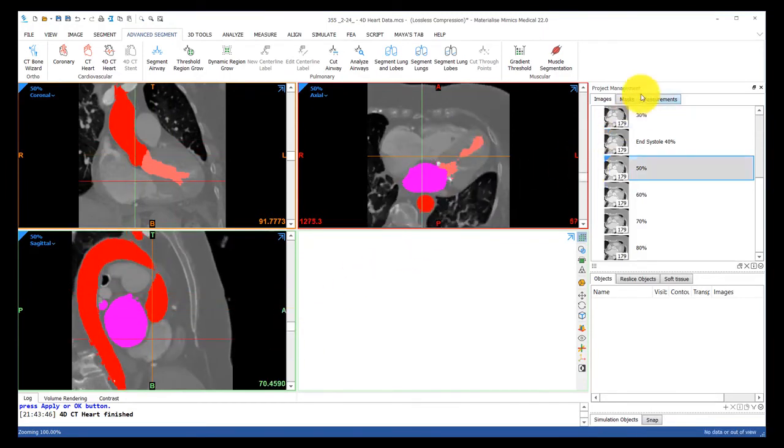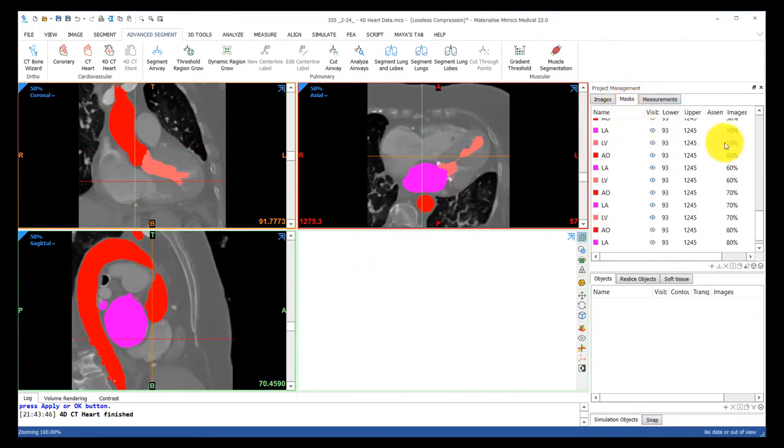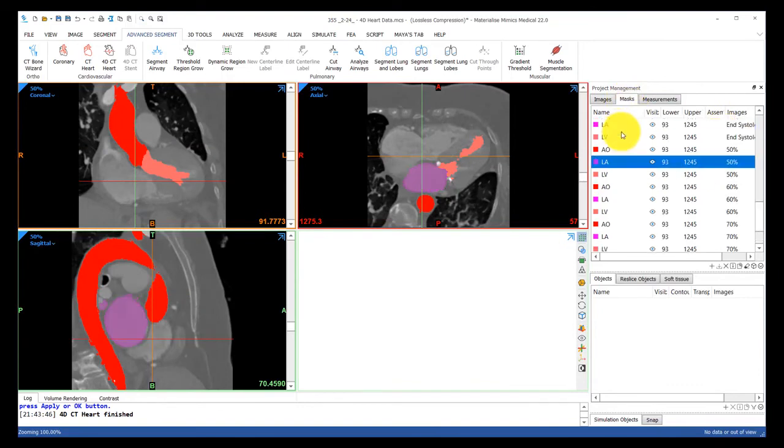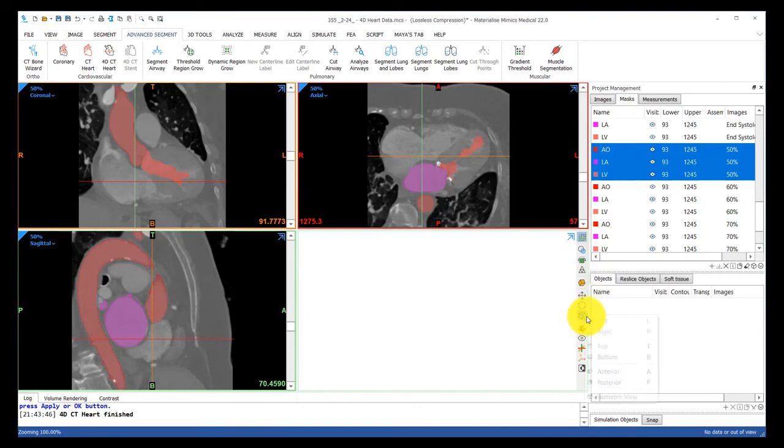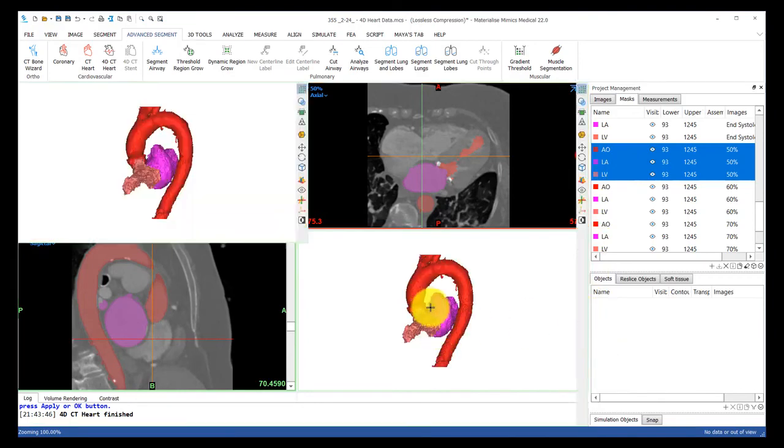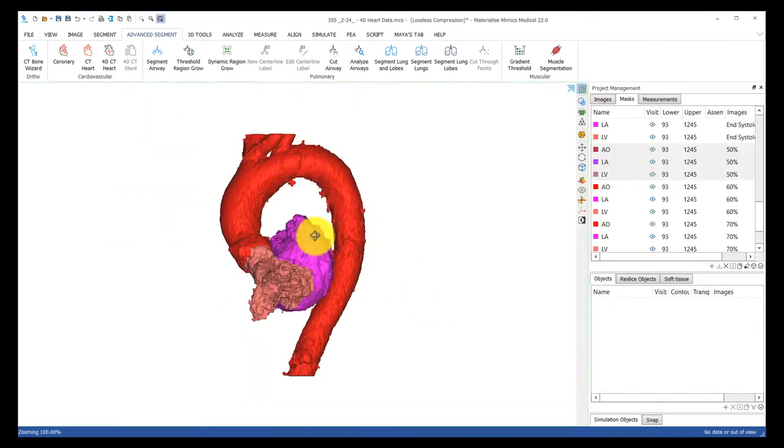I'll now head back over to the mask tab, find the masks associated with phase 50%, highlight them, and now we can see it in the 3D view.